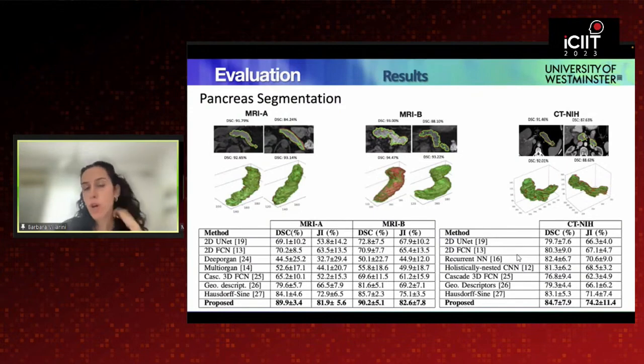We also showed these results to an expert radiologist and radiographer in order to get some qualitative results, and both confirmed that the method produces detailed pancreas contouring, as they said, for every protrusion and indentation, as opposed to an approximate tracing of the organ, which is of paramount importance for an accurate analysis of the organ for making diagnosis for specific illnesses.